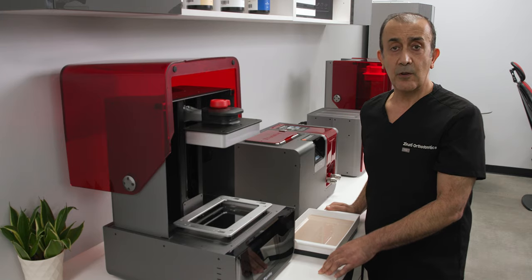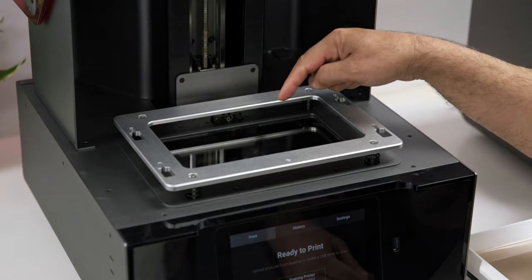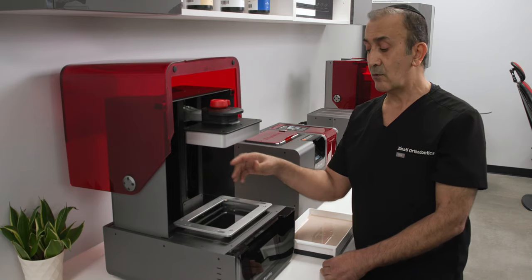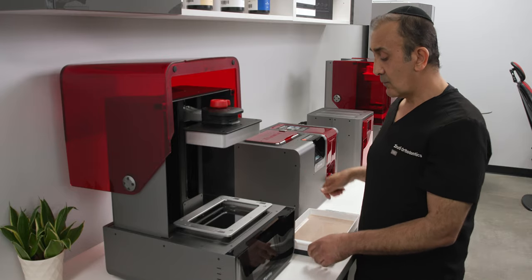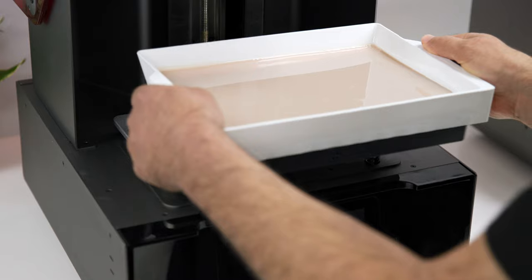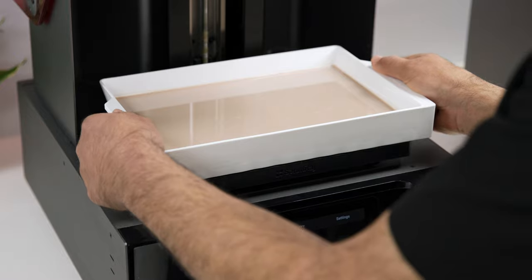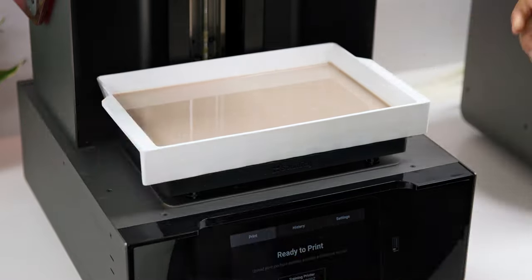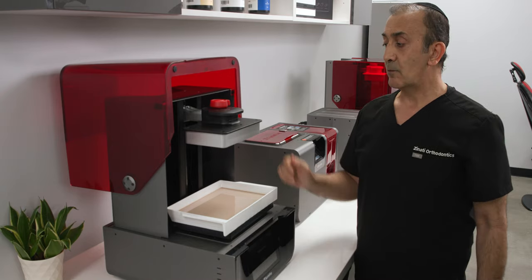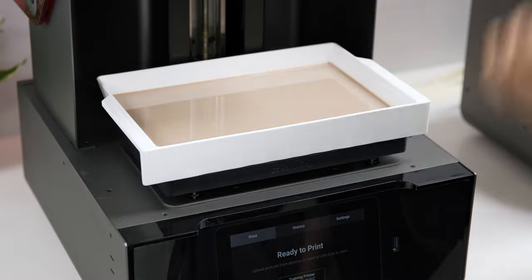Before we're ready to print our models, we want to make sure the glass underneath the resin tank is totally clean — no dust or fingerprints. When we put the resin tank on top, make sure we don't touch the bottom of the resin tank. The next step is to make sure your build plate is also totally clean before starting the print.